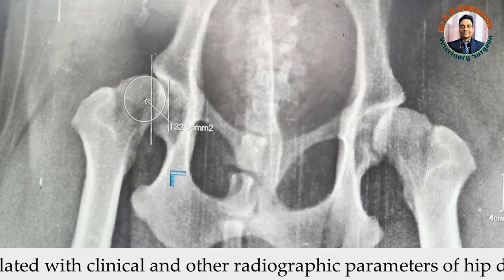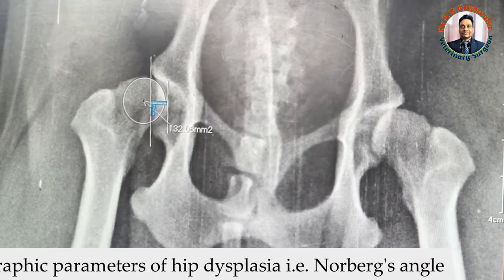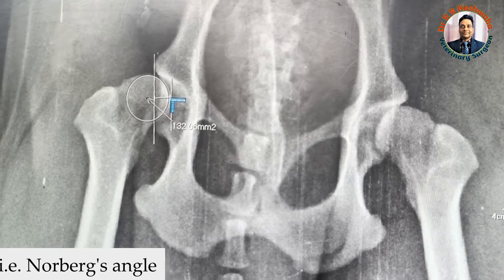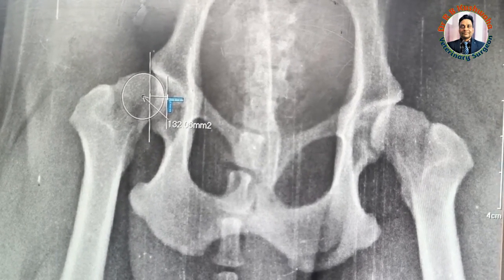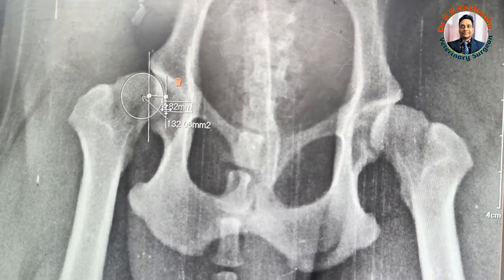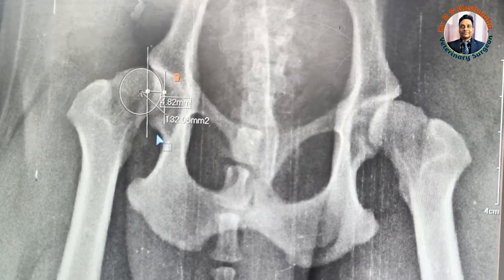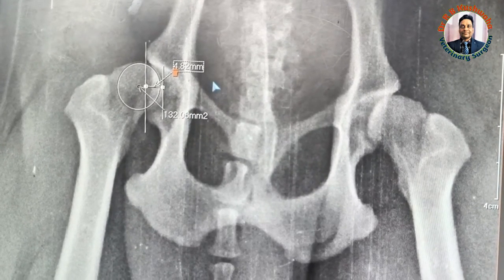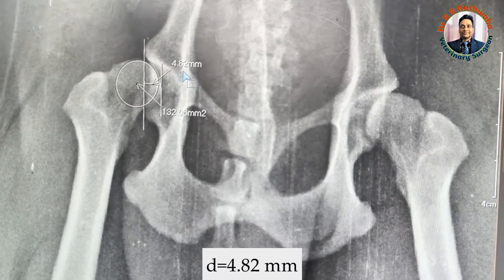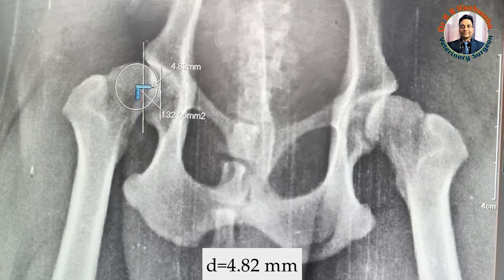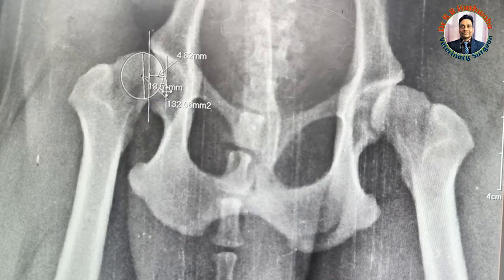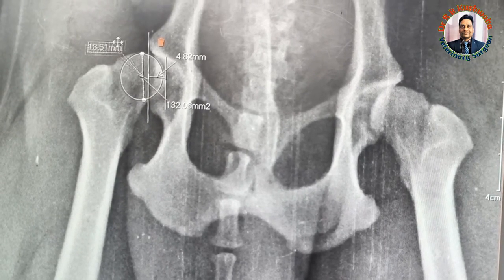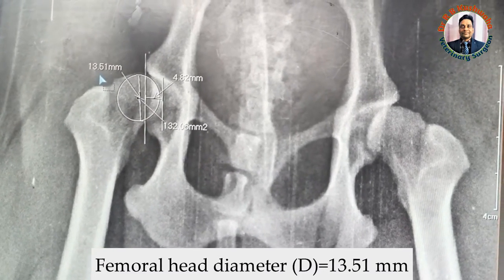The next step is to measure the distance between the line drawn from the cranial acetabular rim to the caudal rim and the line drawn at the inner surface of the femoral head. You can see this distance is 4.82 millimeters. We also measure the diameter of the femoral head, which comes to around 13.51 millimeters.